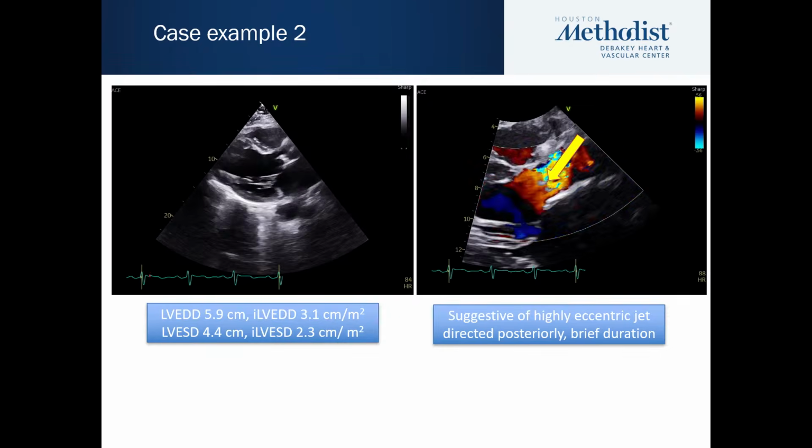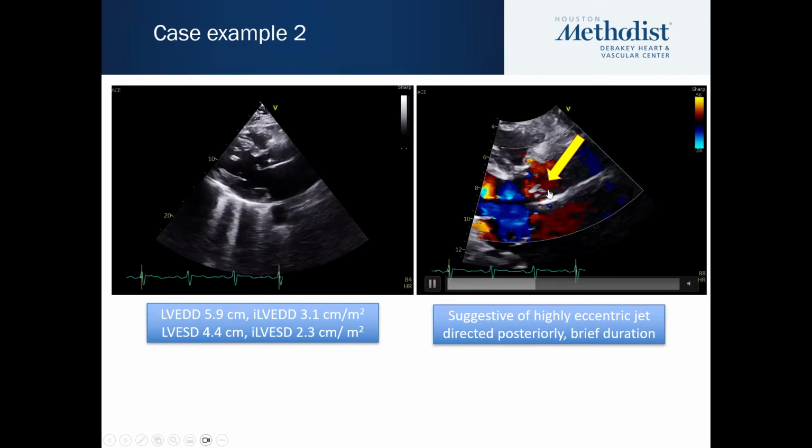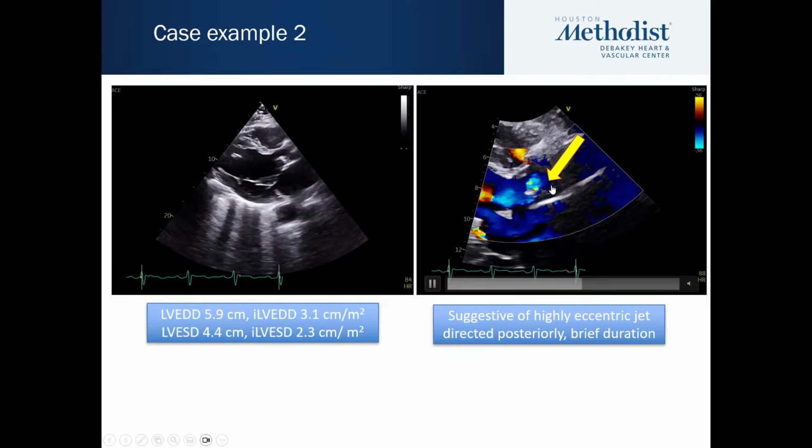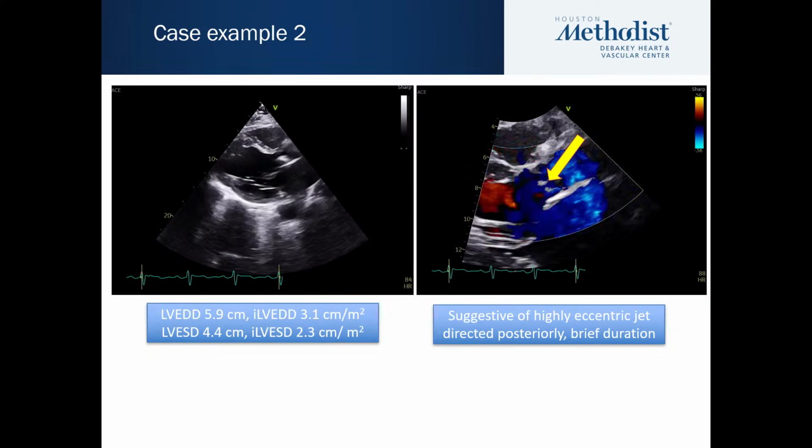I'm not interested in what's happening here. I only want to focus on what's happening here, and then you sweep. You show the origin of the jet.